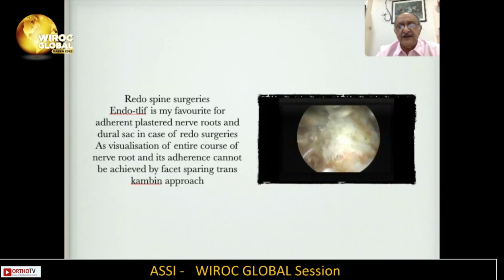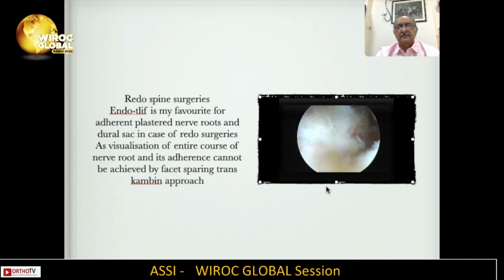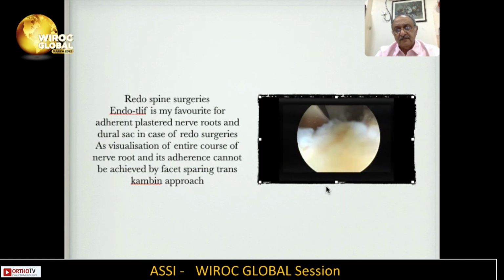UBE is advantageous surgery, especially when it comes to doing a redo surgery. A redo surgery is very difficult. Endoscopic TLIF, especially in a recurrent disc herniation, holds a great advantage where one can identify the facet, osteotomize it completely, push away the dural sac with all its adherent tissues, then identify the root which is completely plastered.